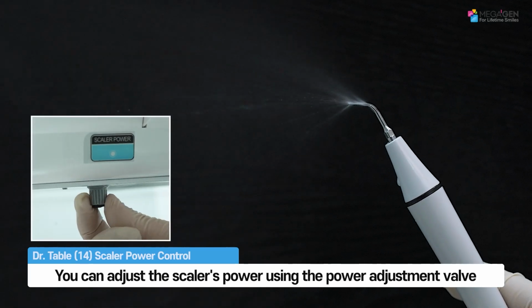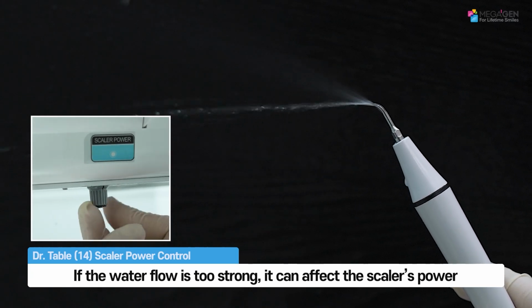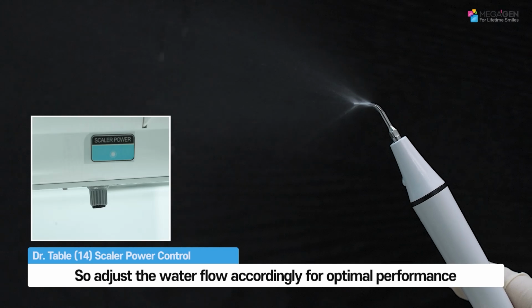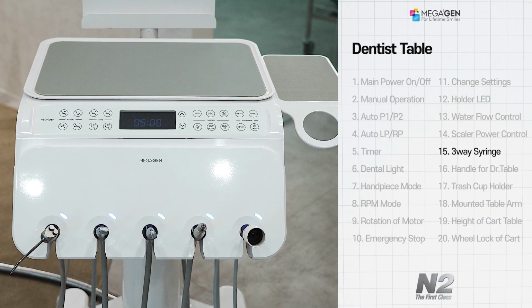You can adjust the scaler's power using the power adjustment valve. If the water flow is too strong, it can affect the scaler's power, so adjust the water flow accordingly for optimal performance.